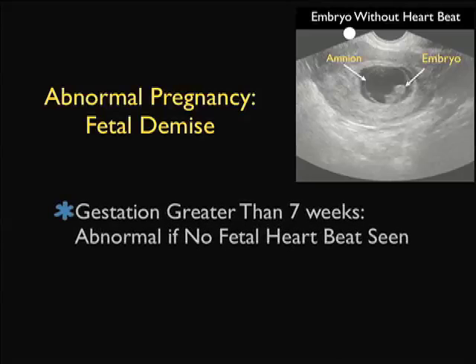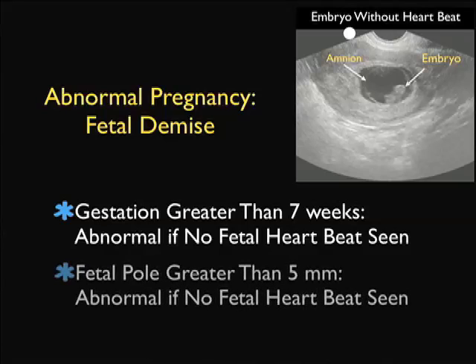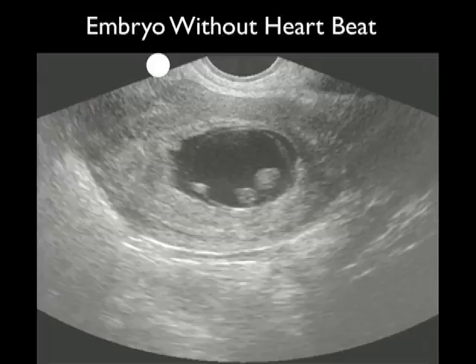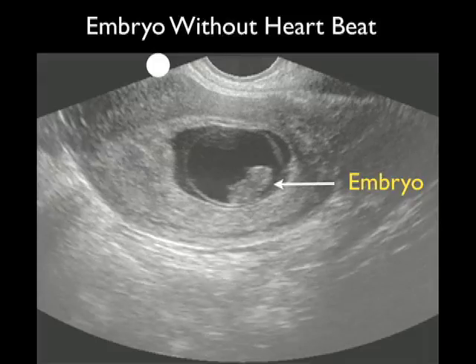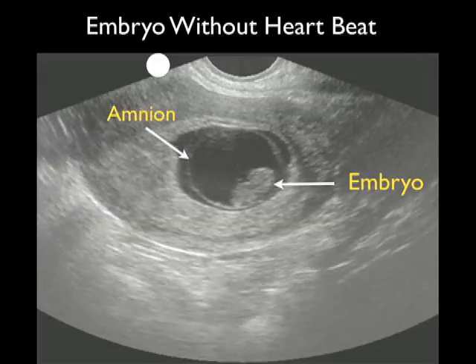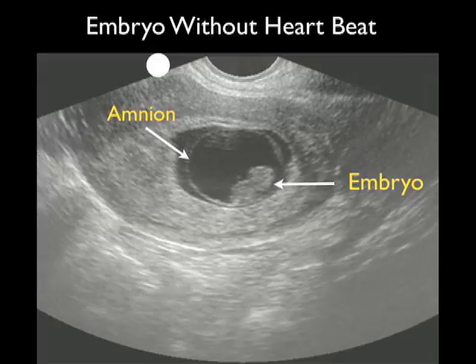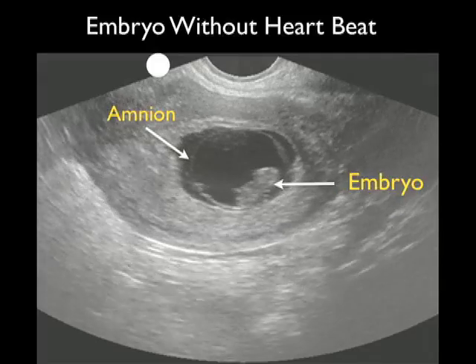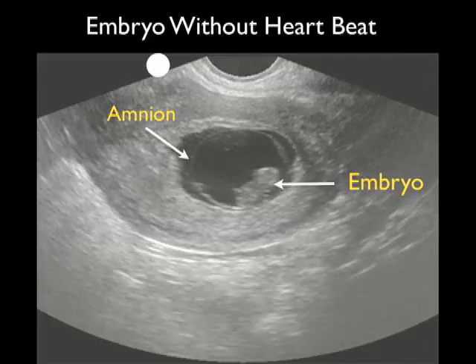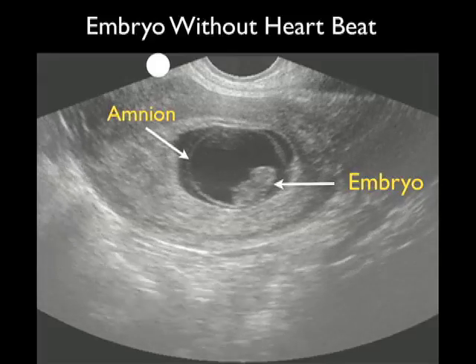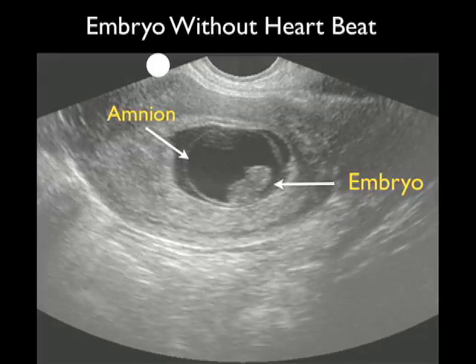Other indicators of an abnormal pregnancy with fetal demise include gestation greater than 7 weeks with no fetal heartbeat, and a fetal pole greater than 5 millimeters without a fetal heartbeat. This was an unfortunate case showing a large fetal pole greater than 5 millimeters without a heartbeat, indicative of embryonic demise, with a large circular amnion visible within the gestational sac. While it's important to pick up findings of an abnormal pregnancy, I always get a confirmatory ultrasound and/or OBGYN consultation before giving the patient the news of fetal demise.